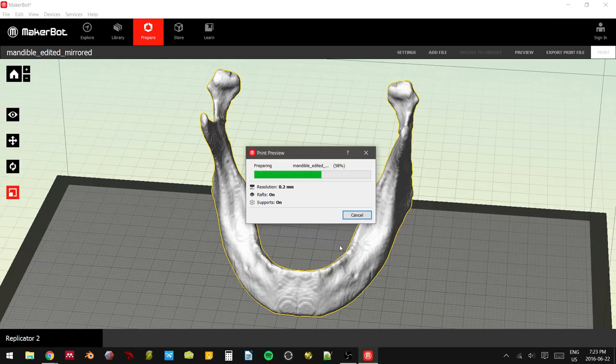We try and stay away from those for a variety of reasons, including cost and reliability. No doubt the models that they produce are pretty good. The ability to control the meso level structures and actually control how strong your parts can be is limited at best. Plus, again, the cost is just insane for each print and the actual service contracts involved in those and such.